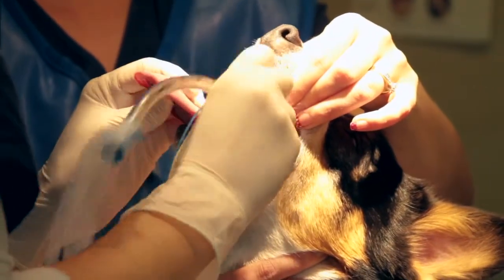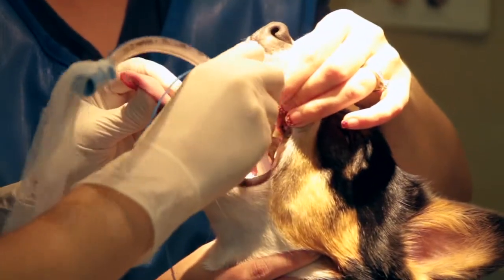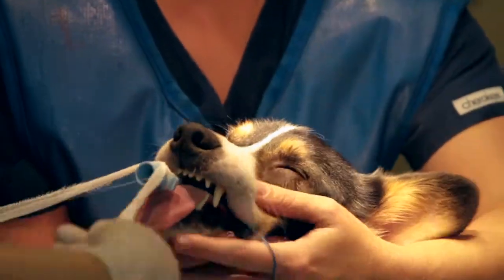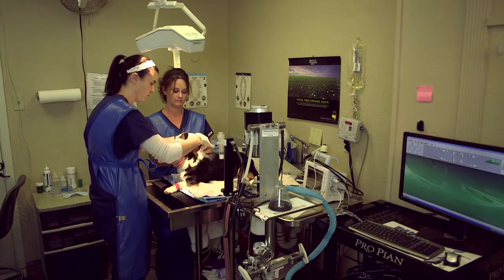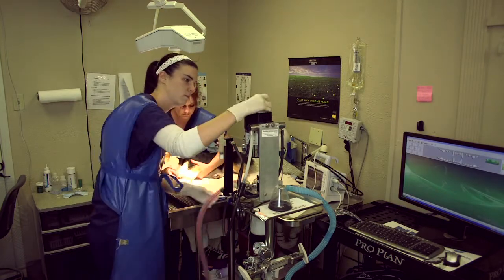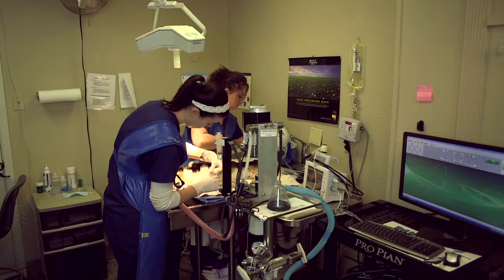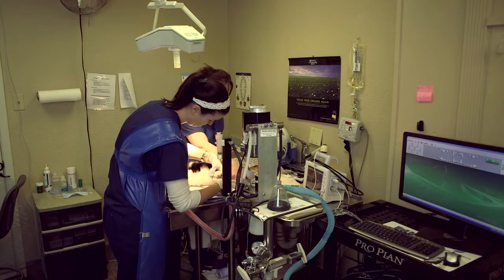so we can make sure that SNAP can breathe, and we're going to supplement pure oxygen mixed with a gas called isoflurane that will keep SNAP asleep. The isoflurane is very nice in that it's very short acting, so if we need to increase or decrease the depth of anesthesia, we simply turn the knob on the machine and she breathes more or less of the gas. And remember that SNAP is breathing pure oxygen with about a 3% isoflurane added, so 97% oxygen and 3% isoflurane. Room air is roughly 20% oxygen, so quite a bit.